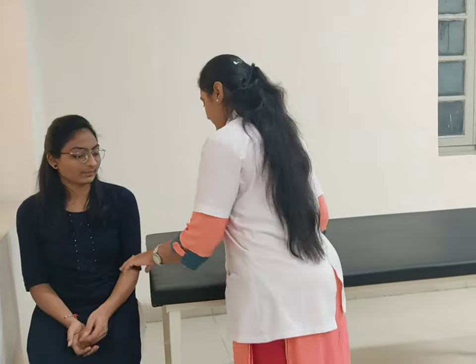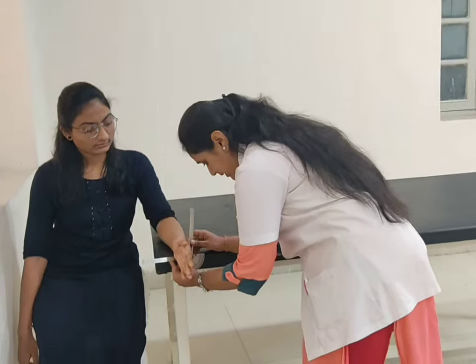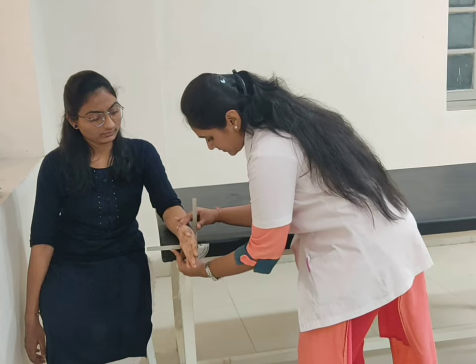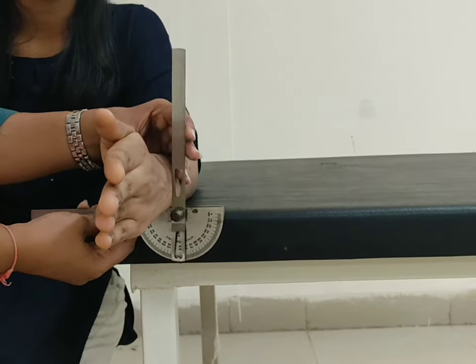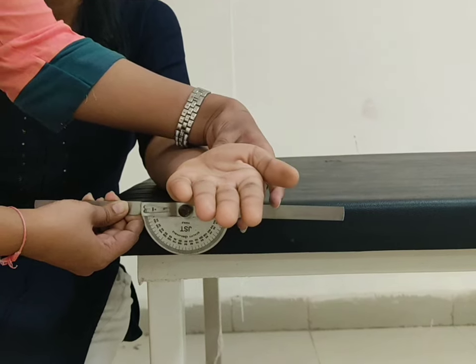For supination, patient position sitting on a table. Forearm in mid-line position and supported over the table. Fulcrum at the ulnar side. Stable arm parallel to the ground and moveable arm at the dorsal aspect of the wrist. Now ask the patient to rotate your forearm so that the palm faces towards the ceiling. Normal range of supination is 80 degrees.